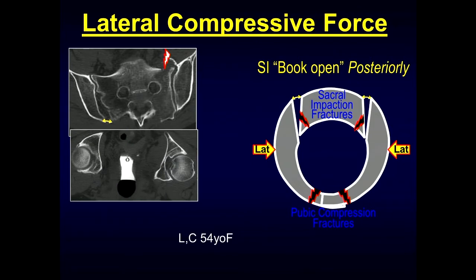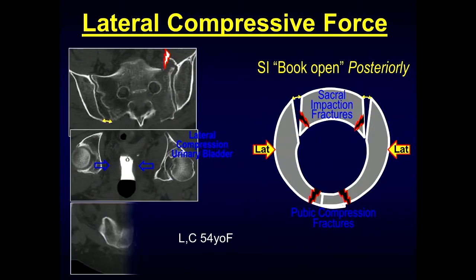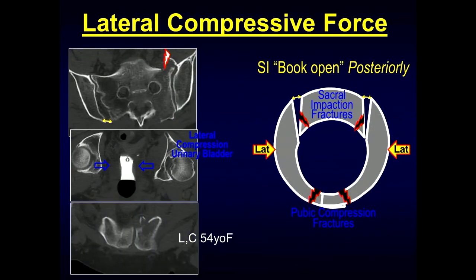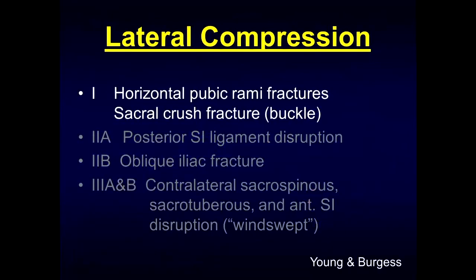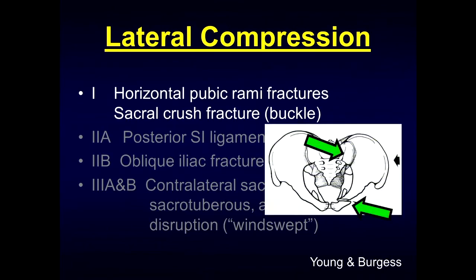As we move more into the pelvis on this axial acquisition, we can see lateral compression of the urinary bladder secondary to hematoma, as well as those pubic fractures. The lateral compression also has three different types. With type 1, you have horizontal pubic rami fractures and you get sacral crush or buckle-type fractures.